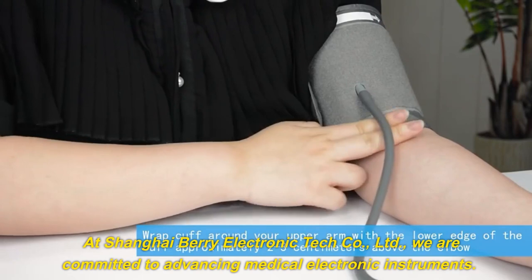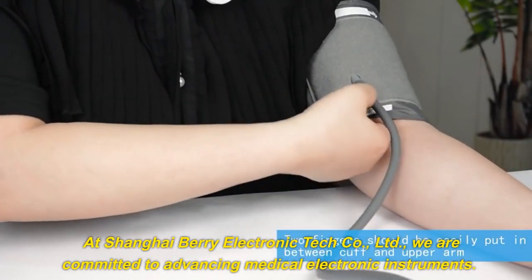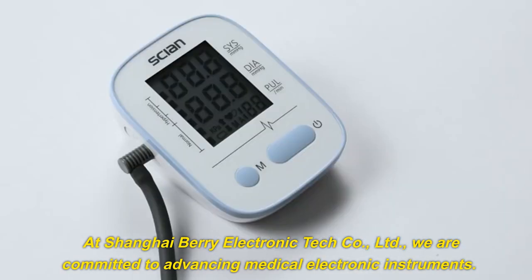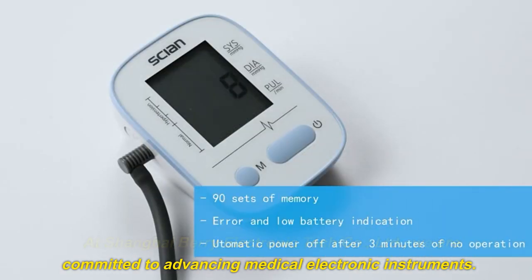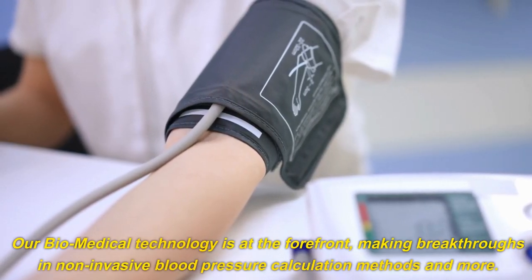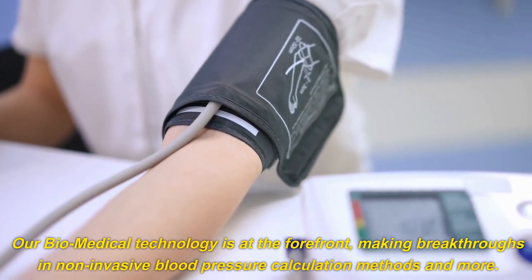At Shanghai Berry Electronic Tech Company Limited, we are committed to advancing medical electronic instruments. Our biomedical technology is at the forefront, making breakthroughs in non-invasive blood pressure calculation methods and more.